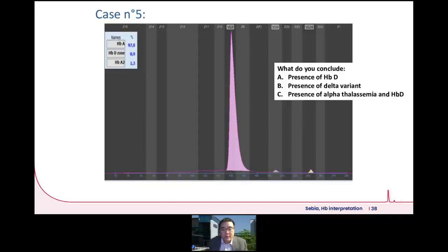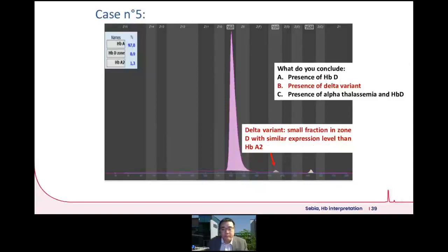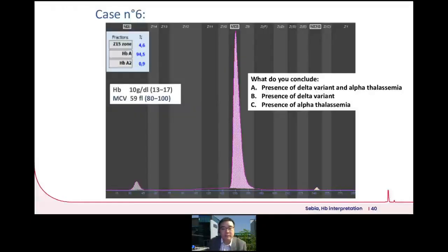So in this instance, you also see a splitting of the hemoglobin A2. So this is a situation of the presence of a delta variant. If you combine the two values together, the hemoglobin D zone and hemoglobin A2, it's still within the normal range of hemoglobin A2.